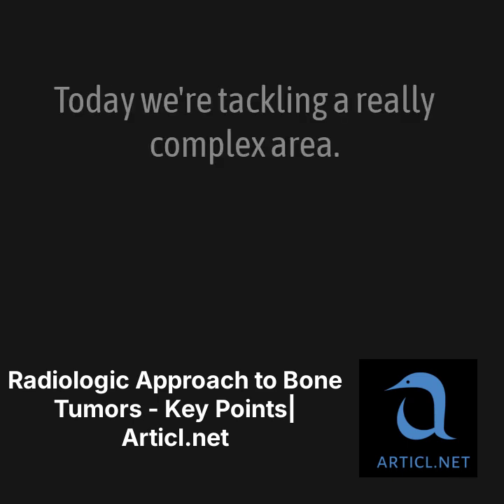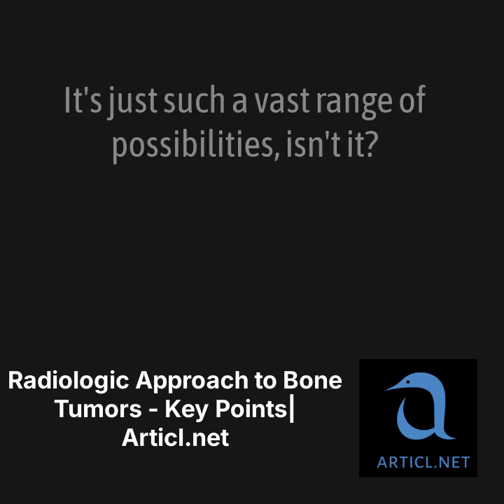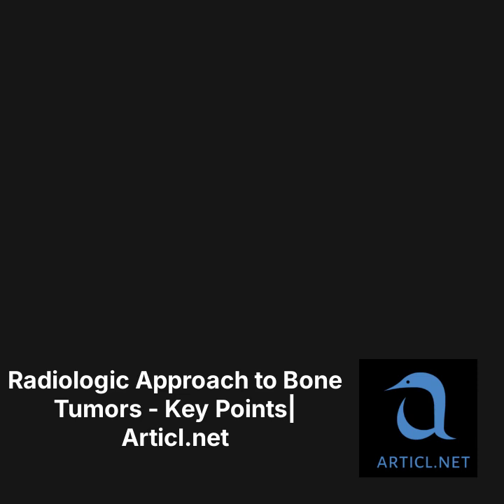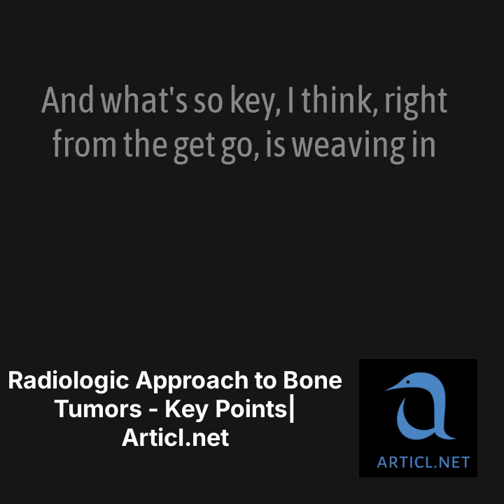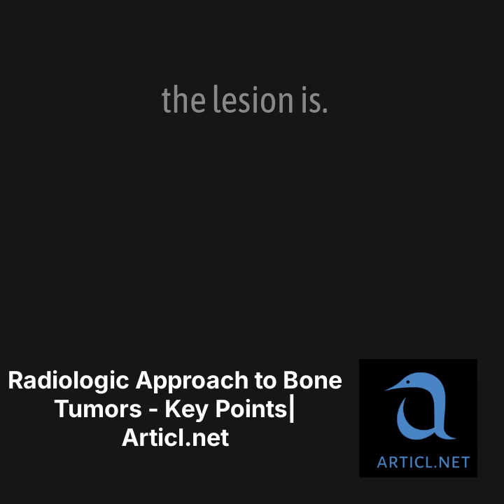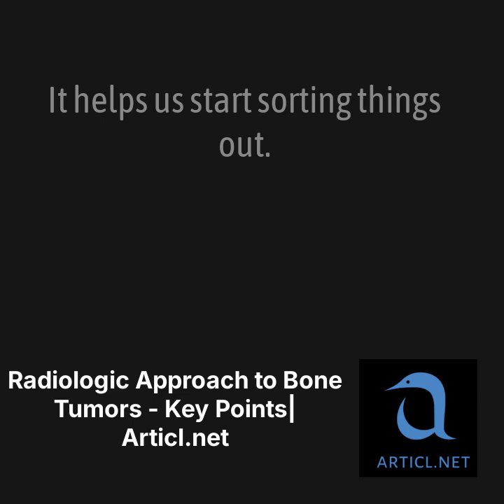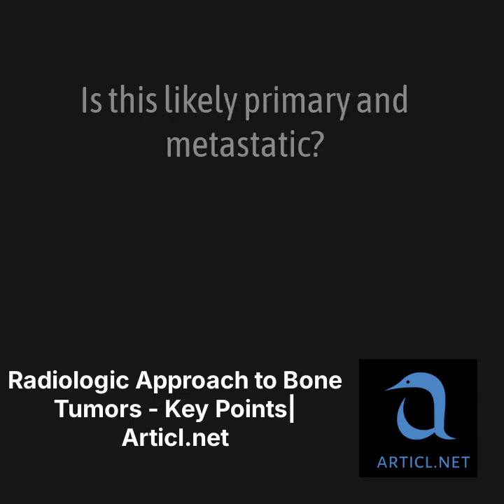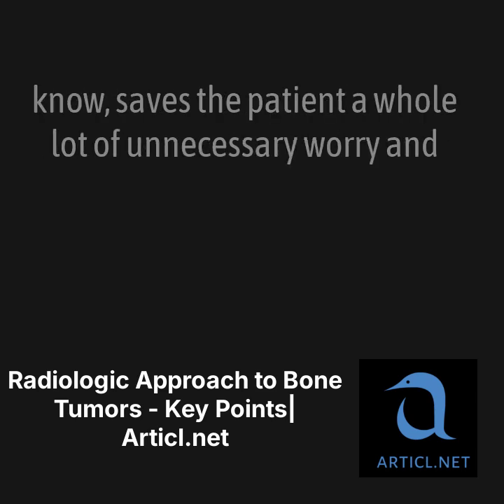Today we're tackling a really complex area, musculoskeletal tumors. It's just such a vast range of possibilities, isn't it? Right. It really demands a systematic, multimodal kind of thinking. Absolutely. And what's so key, I think, right from the get-go is weaving in those clinical factors: the patient's age, exactly where the lesion is. Right, that initial assessment is like our first filter. It helps us start sorting things out. Is this likely primary, metastatic, or maybe even one of those don't-touch lesions, which saves the patient a whole lot of unnecessary worry and procedures.